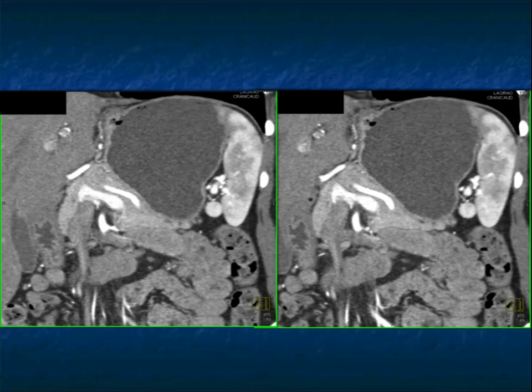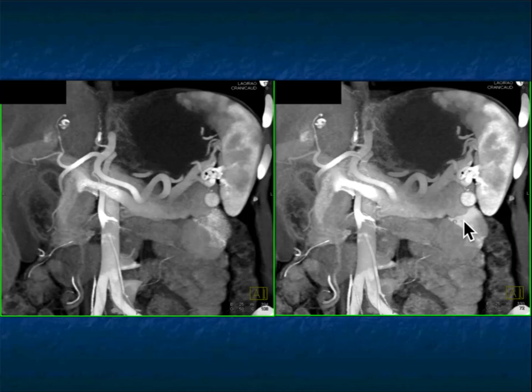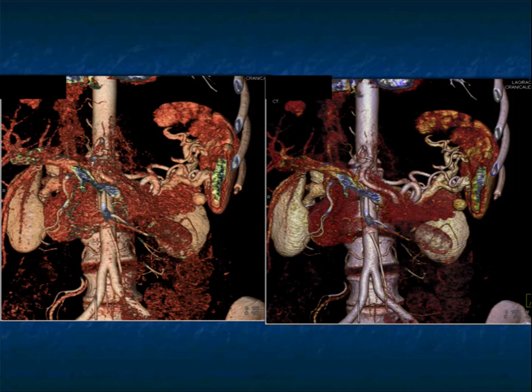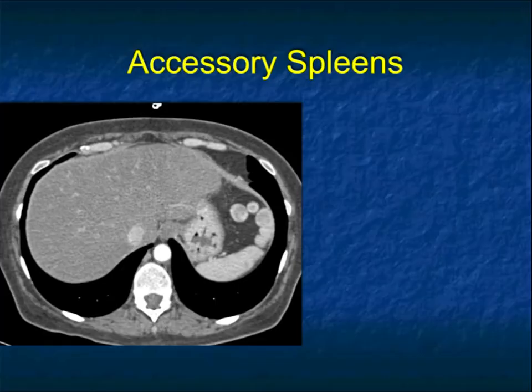Another example shows a very bright lesion away from the pancreas that comes closer on later phase imaging but remains clearly separate and brighter — not to be confused with a neuroendocrine tumor. On 3D imaging you can see how it sits at the undersurface of the spleen, very much like the schematic diagram.